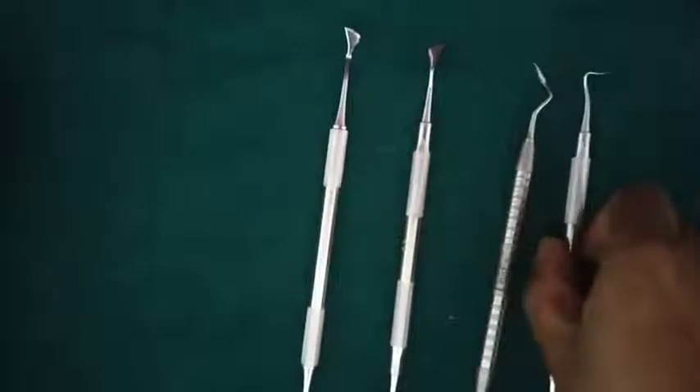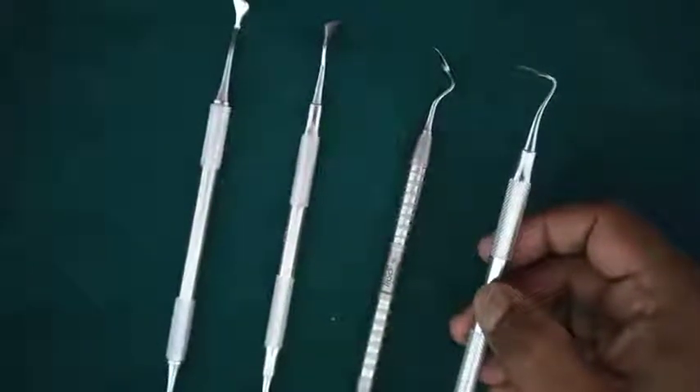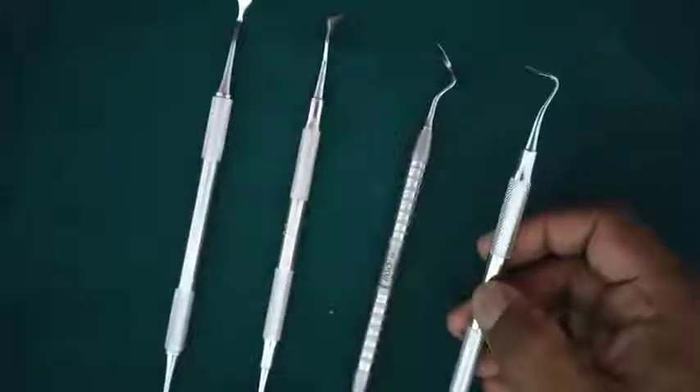The last knife which is very commonly used is Buck's Interdental knife. The Buck's Interdental knife is also used to remove interdental tissue in periodontal flap surgery. Thank you.